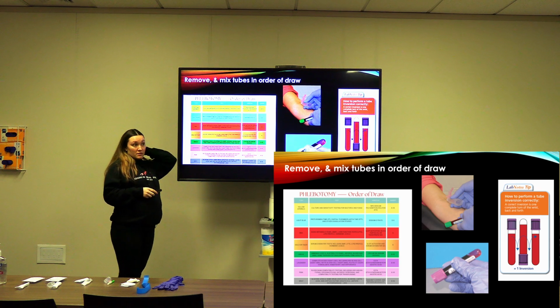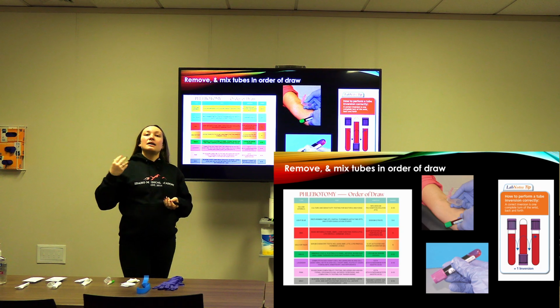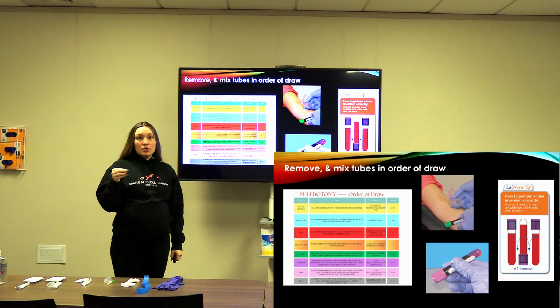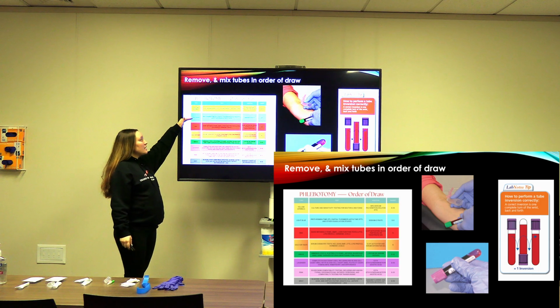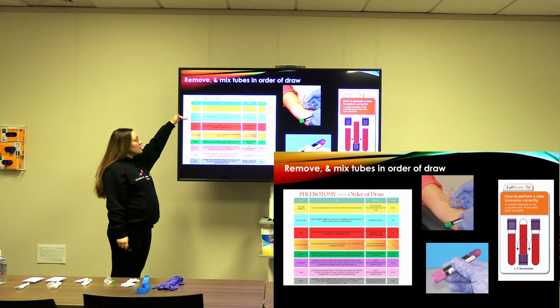And generally, as a venipuncture is performed, the most blood that you're going to get, or the highest pressure that you're going to get, is at the beginning of the draw. Okay, so we want to make sure the light blue tube is full due to the ratio. So sterile tubes, light blue, red, then gold or tiger top.